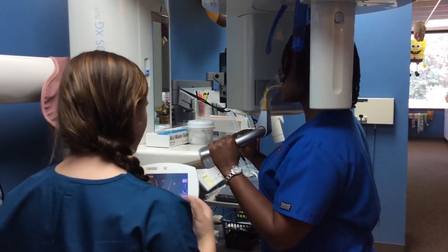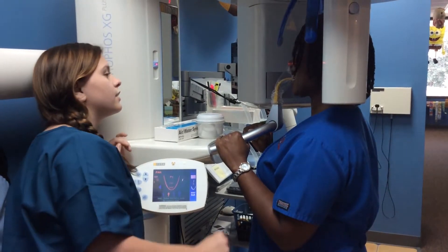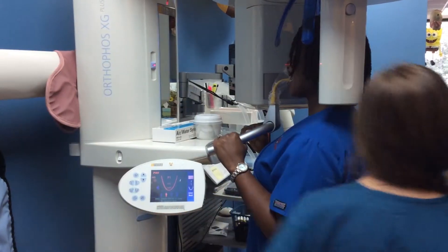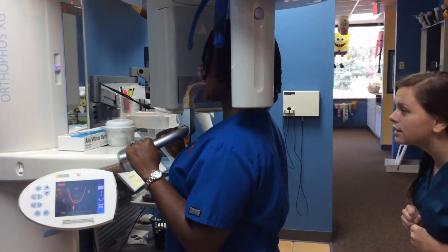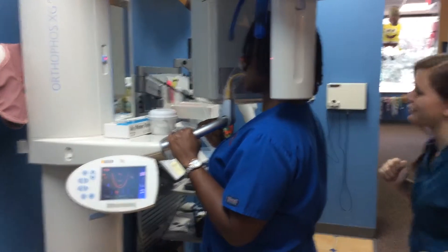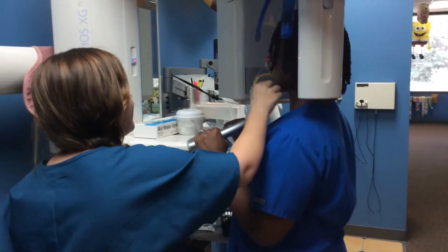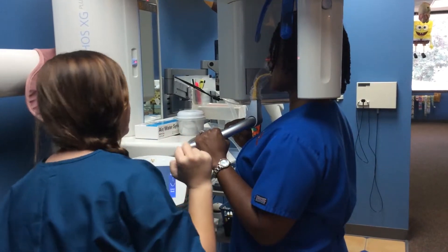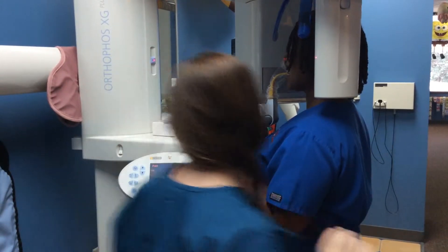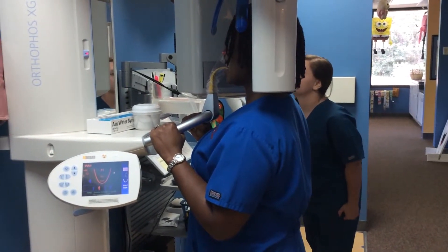Put your hands on your handlebars. Step up for me a little bit. And then we're going to put your little light beam on. We'll come back here to see a little better. Let's see which side of your face it is. I think I need to push your face a little — okay, that way. Perfect. And now I'm going to come over here and press the panoramic button.